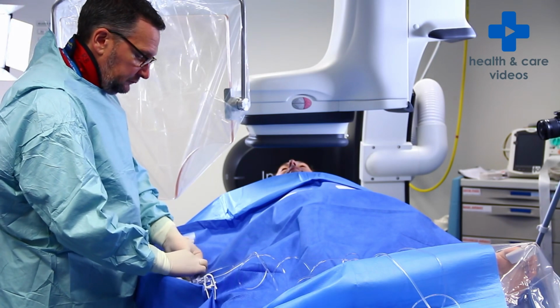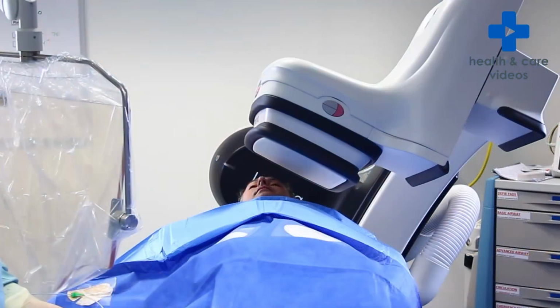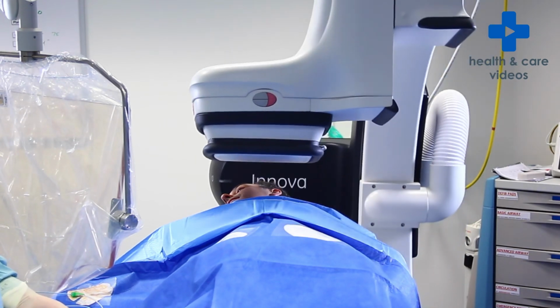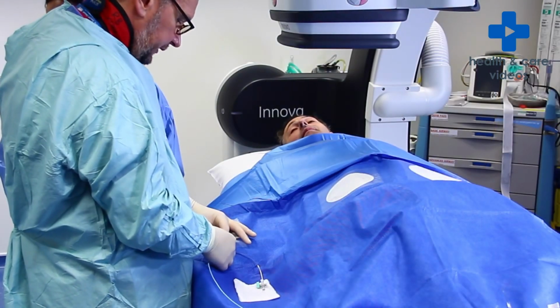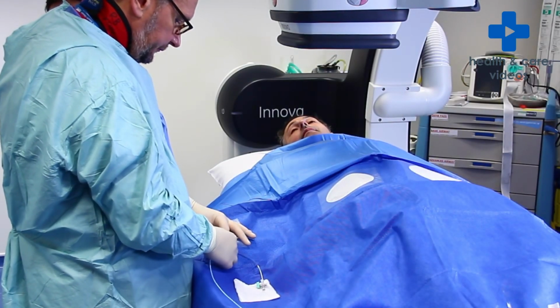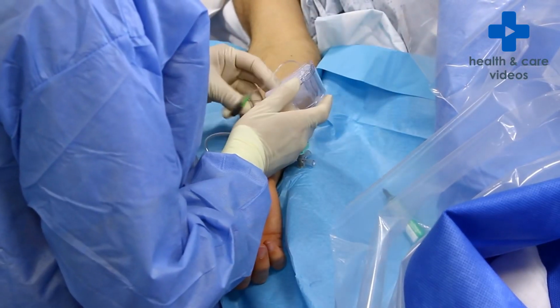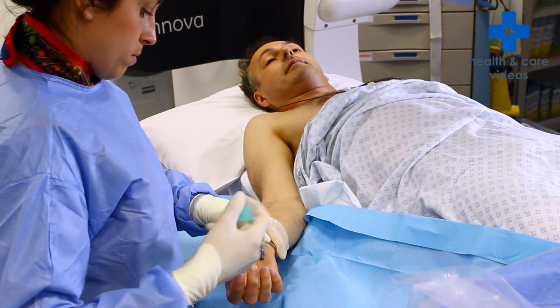When the tip of the catheter is in one of the coronary arteries, the dye is injected, and multiple X-rays are taken to see the flow of blood in the coronary arteries. This sequence may be repeated several times in different coronary arteries. Once complete, the catheter is removed, but sometimes the sheath may be left in place and removed in recovery. When it's removed, we will place a sealing device on the insertion site to stop any bleeding. This will be stuck on very tightly to put pressure on the wound. The whole procedure should take about 30 minutes.